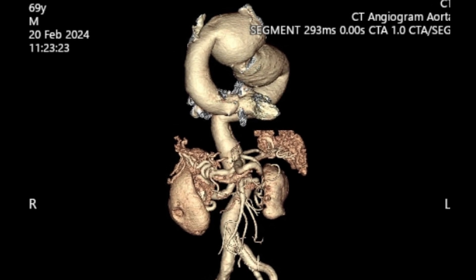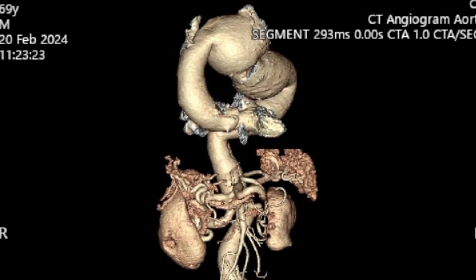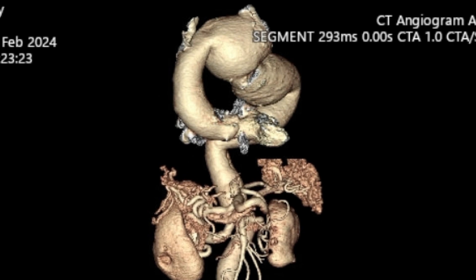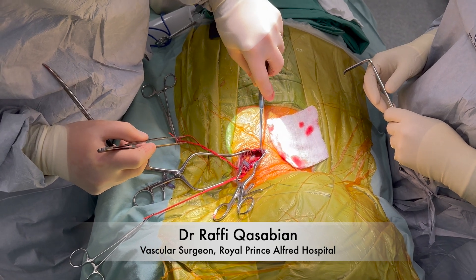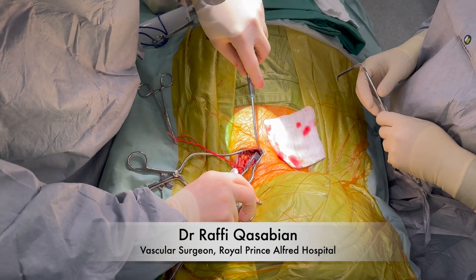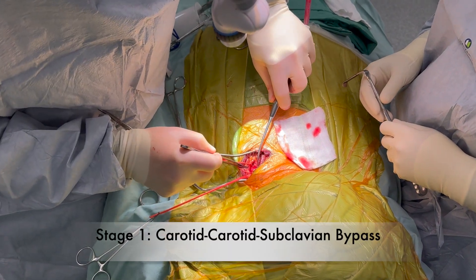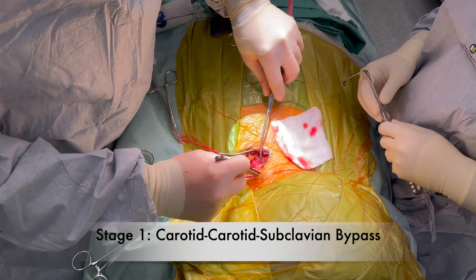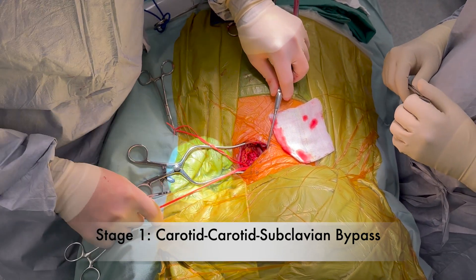The patient is quite stable, and our vascular surgeon is going to perform the carotid-subclavian bypass at stage one. Dr. Rafi Kwasavian is here exposing the left common carotid artery and the left subclavian artery. He's going to perform a carotid-subclavian bypass and ligate the base of the left common carotid artery, so everything will be supplied from the innominate on the right-hand side.